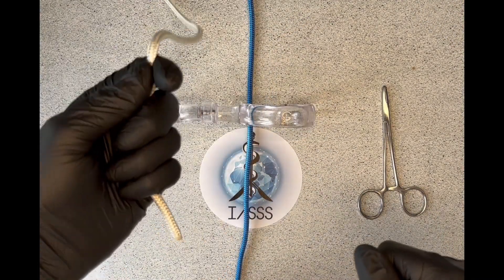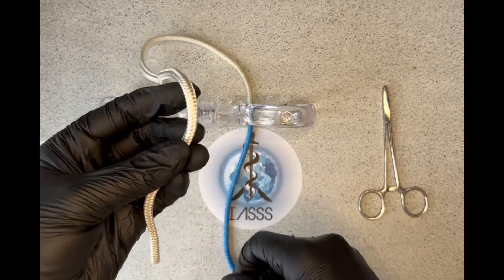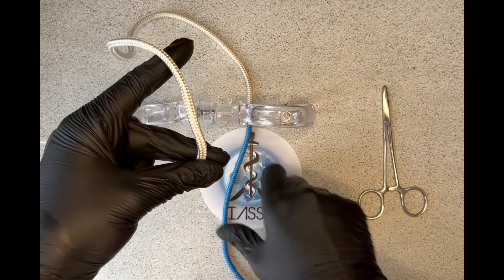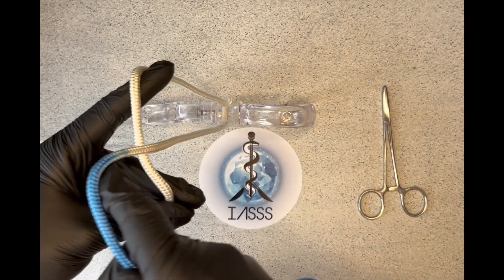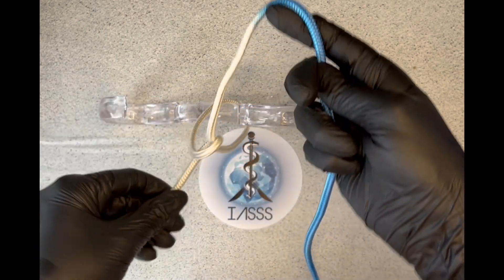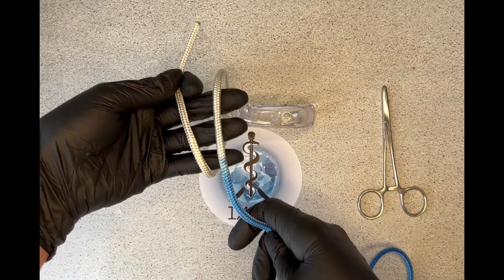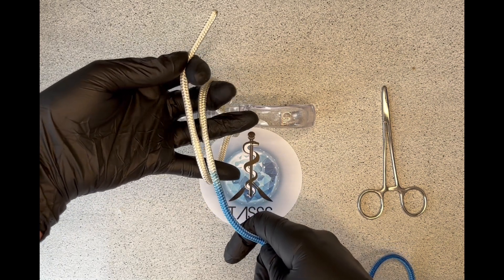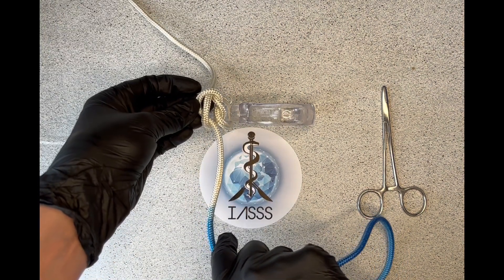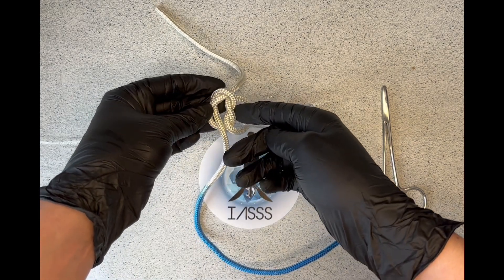Now to show the reef knot with the left hand. Again, you've sutured your material through and pulled it towards yourself. Suture material between your middle finger and thumb, extend your index finger out, bring your suture material up to create a four. Your index finger wraps around and pushes the suture material through and pulls it towards yourself. Left hand flips over, allow the material to run parallel, and your middle finger does the work — over and under — allowing that one to fall through into a beautiful reef knot. It's good to practice on both left and right hand as you may be standing on different sides of the table or suturing in awkward positions.